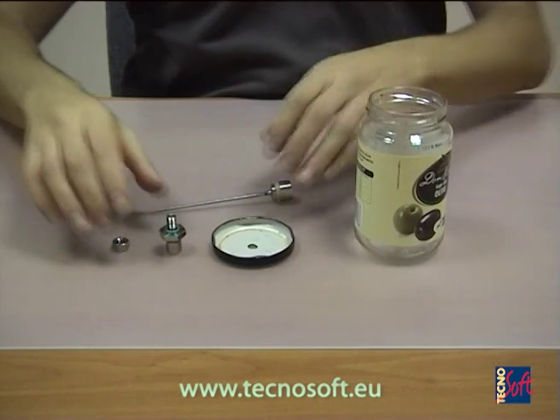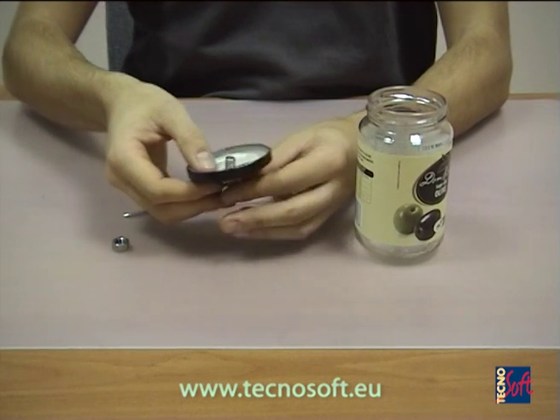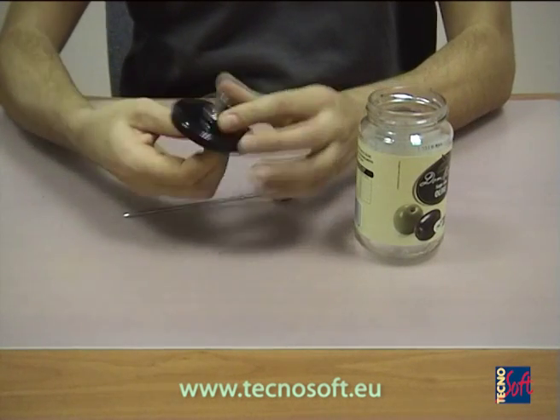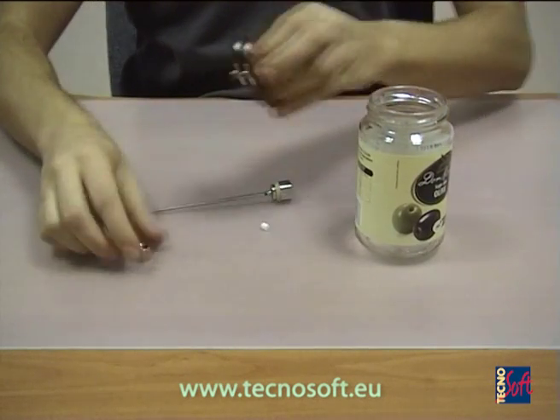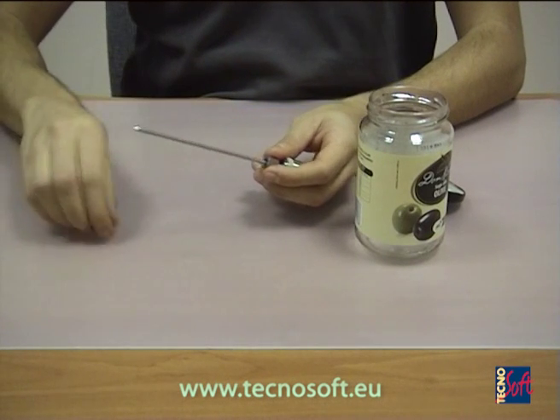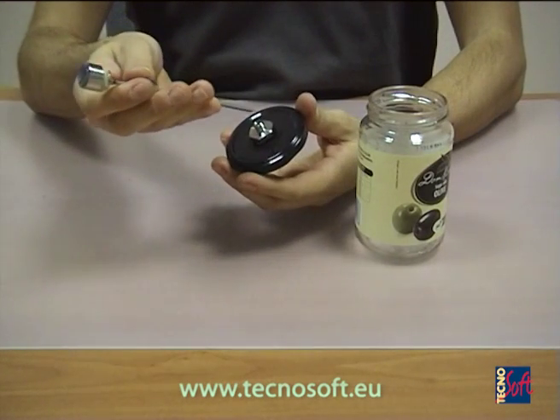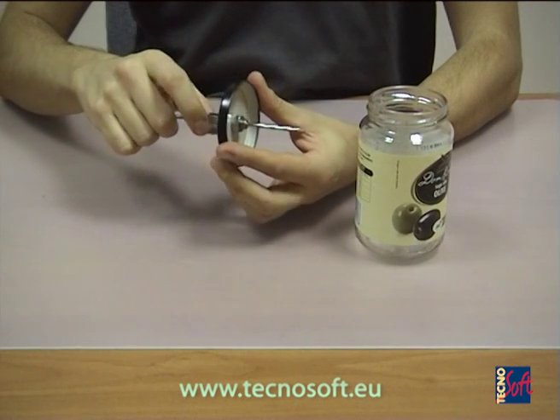We can still use a similar solution even if the probe doesn't have a threaded part. With the locking nut, we place the locking nut in the hole and fix it with the counter bolt. We unscrew the top holed bolt and remove the Teflon olive. We put the holed bolt on the probe and then the stopping Teflon olive, and put the whole probe inside the locking nut.